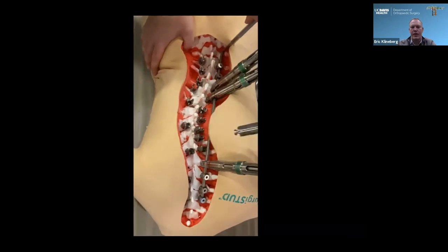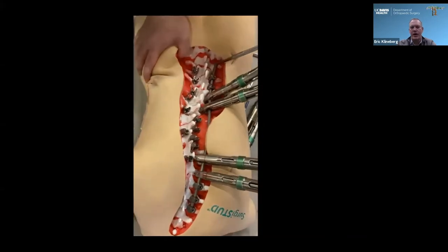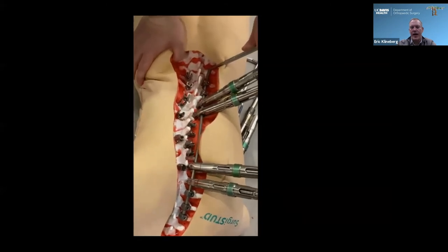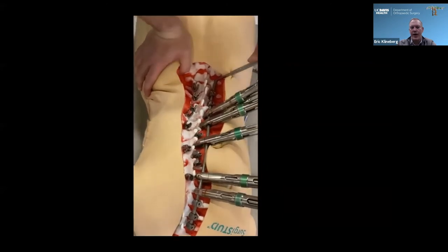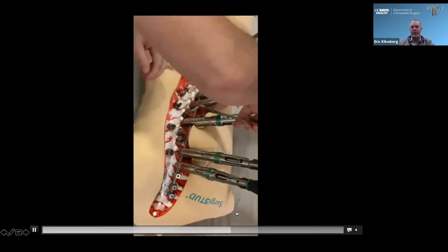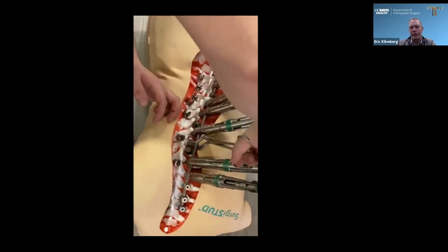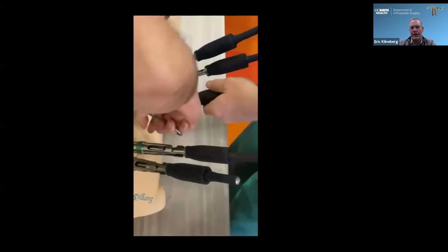You can see already the rod. So now the spine is being translated over to the rod. What happens is that the rib deformity gets worse, not better, as the spine comes up in concert. And so that spinous process is still sticking way off to the side, bringing that rib up. And so that's why that right rod has to be so flat, as to press down on that right side. And you can see we've just about gotten everything all lined up here.